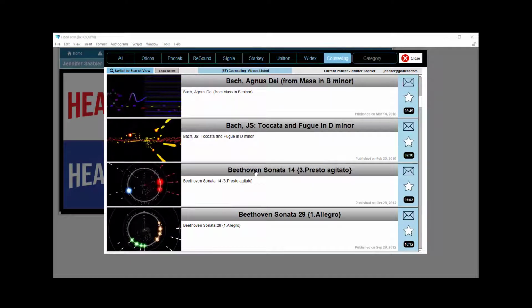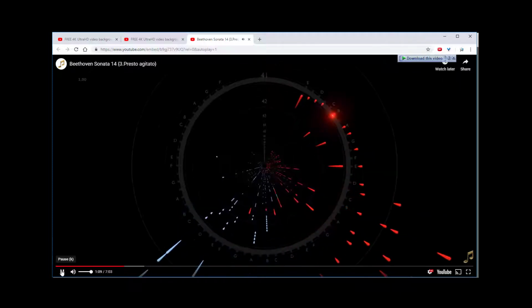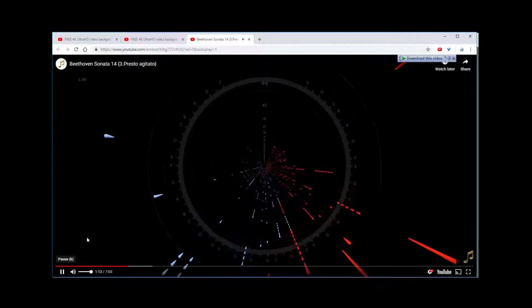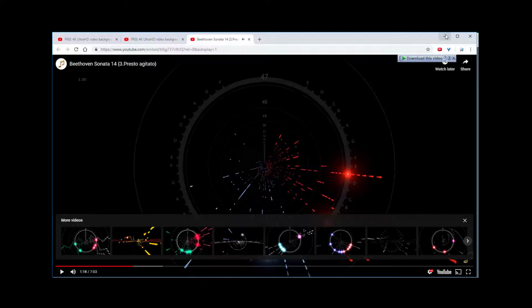Let's say you have to leave the room to get something for just a minute and you want the patient to be able to learn a little bit about how sound works. Well, this particular video, I kind of enjoy it. I'll just fast forward through it. And I'll turn off the sound and just show you there's little notes all around this circle, and it's a nice visual way to show patients the way sound works.